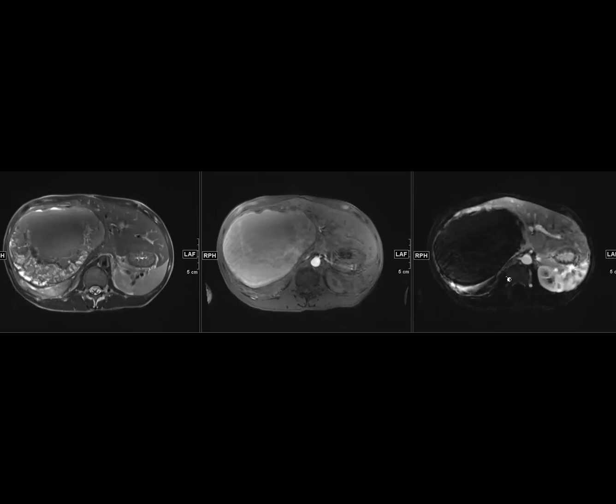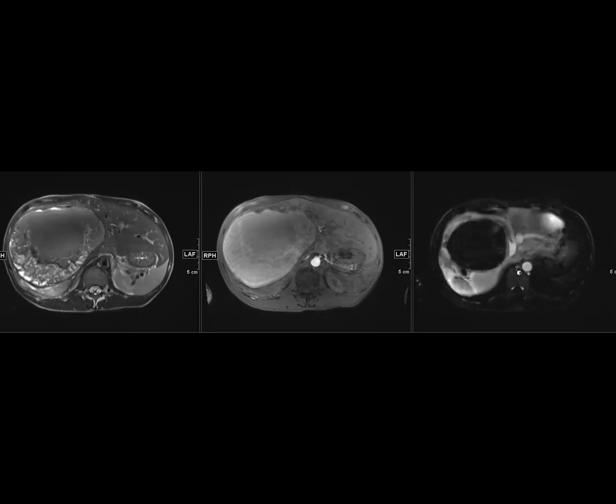Right. That large one was reminding me of an MCN, the cystic parts, but it looks like, with the nodular enhancements, it's not just a complex cyst. Rupa is asking about a hepatoblastoma. Okay, in the 40-year-old? A little old. And the other ones, you said they were washing out. Were they arterially enhancing also?